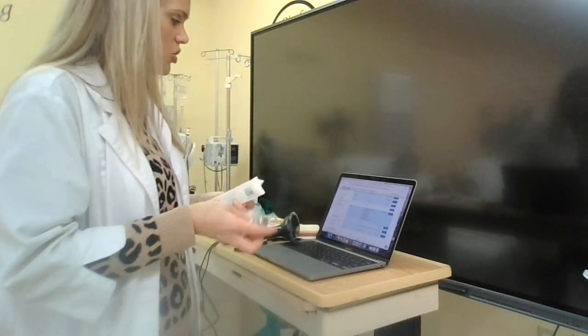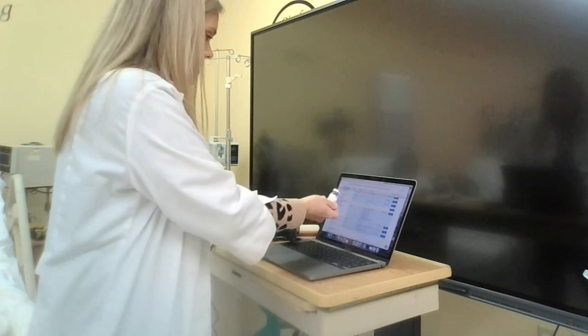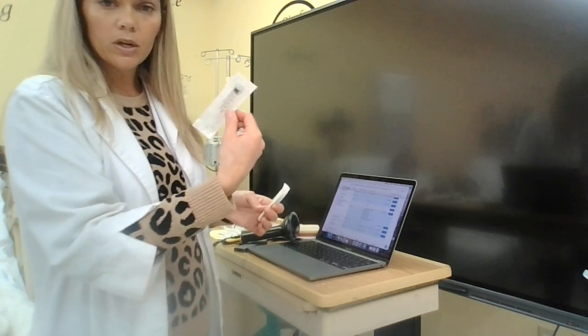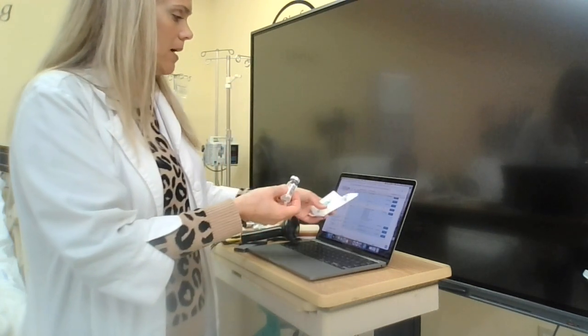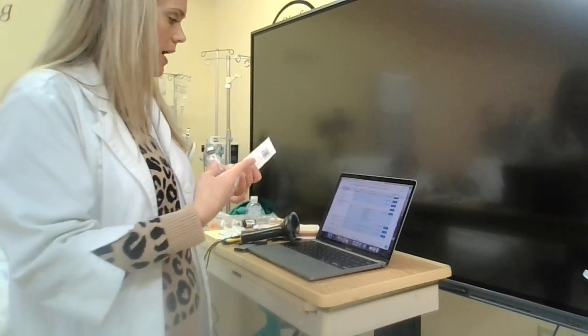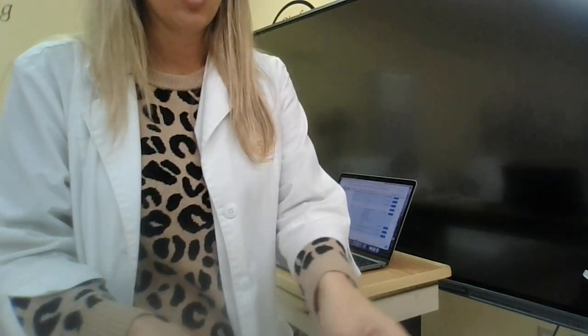So I've got what I need. I'm going to go ahead and do check 1. So I've got Chris Jones. I've got Fluzone. I'm going to be administering 0.5 milliliters, and I have a 3 milliliter syringe, so that will be appropriate. I'm going to be giving it IM today at noon. So I've got patient, drug, dose, route, and time. Same thing with our insulin. Before I do check 2, I'm going to want to go ahead and draw it up.